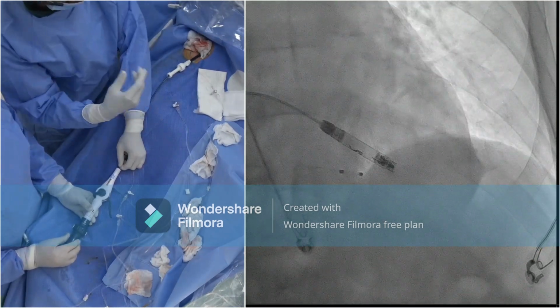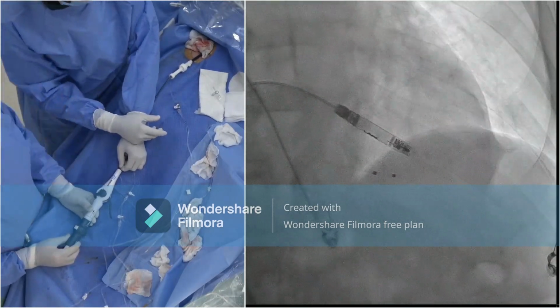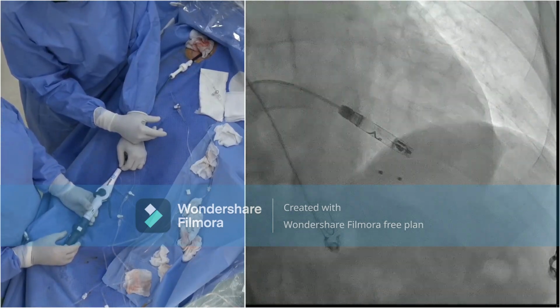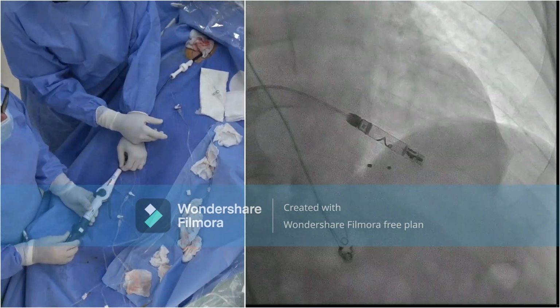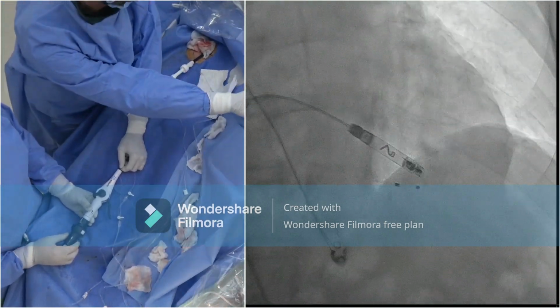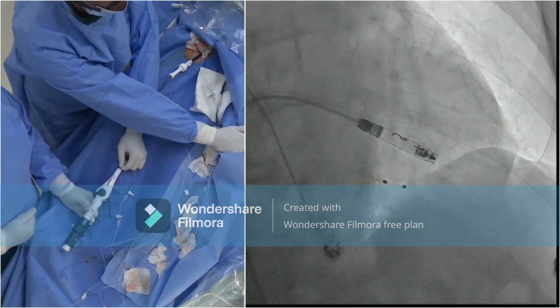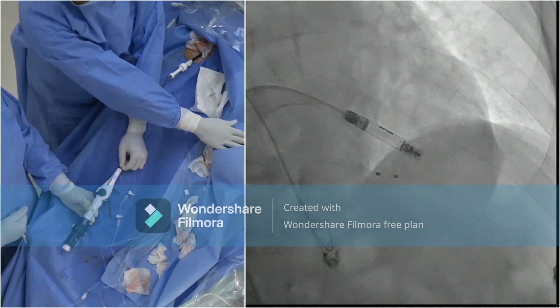So actually at this level, we can carry on. This is a little bit more than 1. Almost, guys. When it goes up, it will be 1.5. Going to do one more and see how it is. And we can wait a few seconds. Yes, I think this is almost 1.5. Do you agree, guys? Everyone agrees?